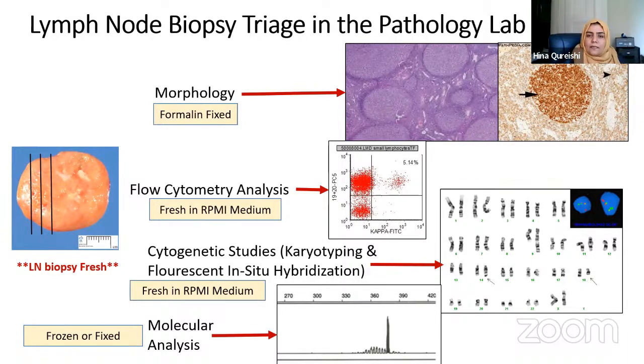So for this case, I'm going to briefly give you an overview. This is an example of a type of lymphoma called follicular lymphoma. The first slide is the hematoxylin and eosin, H&E, slide. What we see are big abnormal nodules that are back to back. A specific immunostain highlights the center part of these nodules, which is called the germinal center. This is a BCL2 stain.